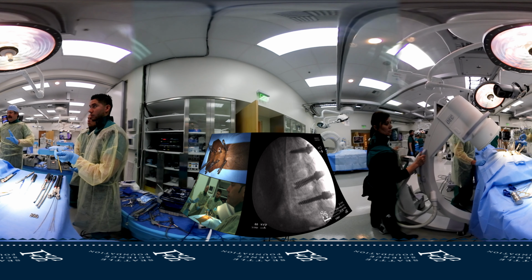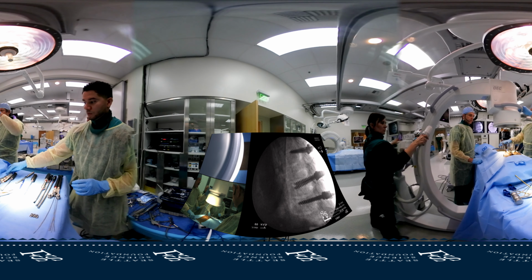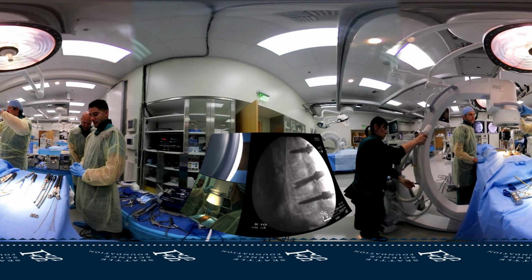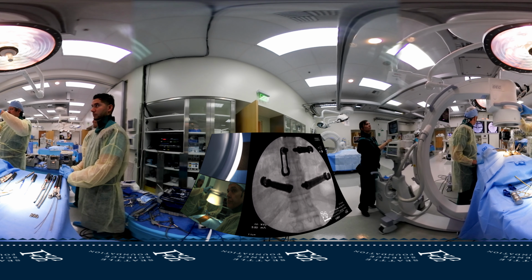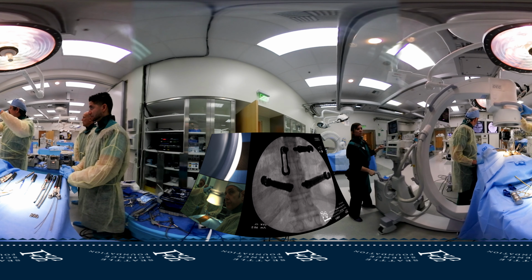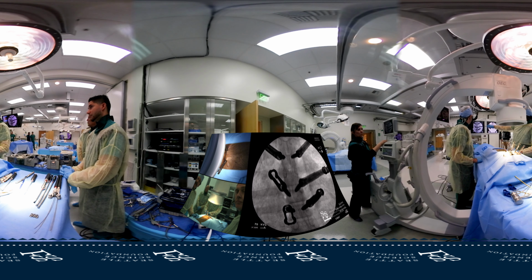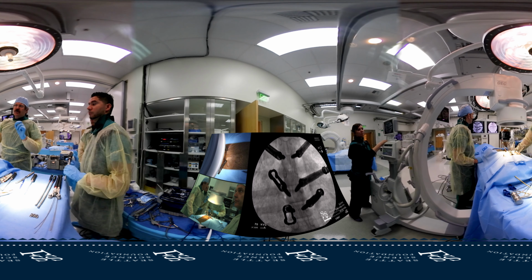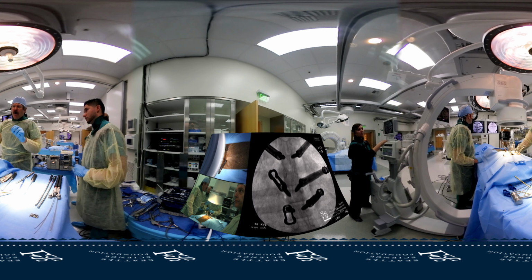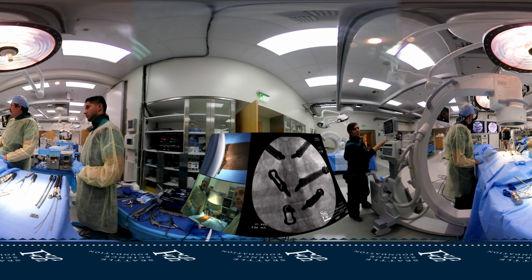Now this screw's all the way in, so it's hard to tell. If you have the screw deep into the vertebral body, it can actually look like it's medial to the pedicle. But this screw, I will tell you, is medial, because when we put it in, we could see it passing medial. Go north, north. Picture. All right, if you take a look at the screw on the right side of the screen, that one started out about the middle of the pedicle, and it crossed the medial border before it was all the way through the pedicle, before it hit the back body. And I can guarantee that one's in the canal.